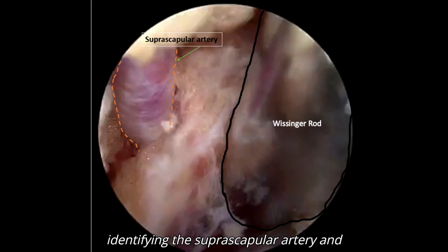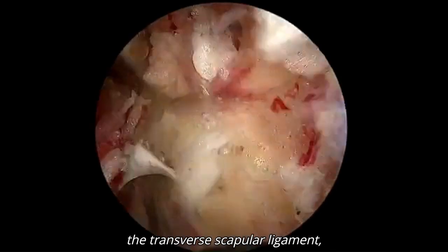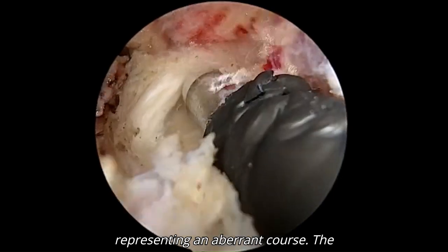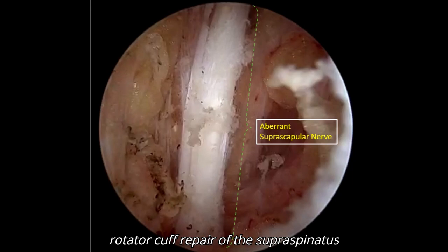After identifying the suprascapular artery and proceeding medially, the suprascapular nerve was found to be traversing above the transverse scapular ligament, representing an aberrant course. The nerve was carefully dissected and its path cleared before proceeding with rotator cuff repair of the supraspinatus tendon.